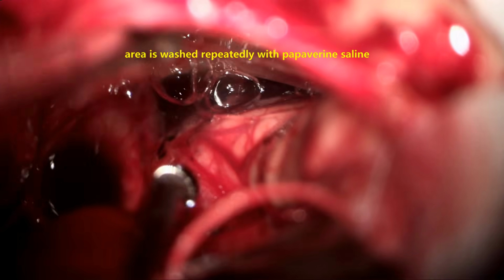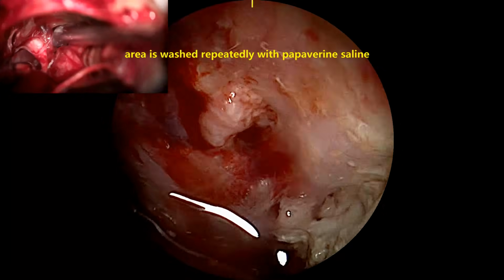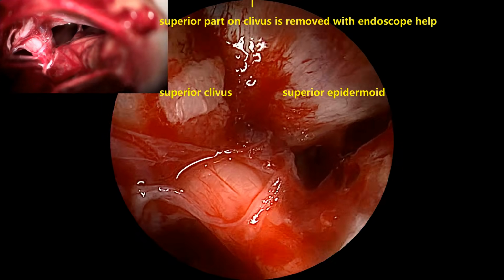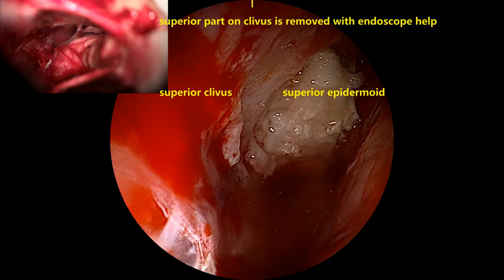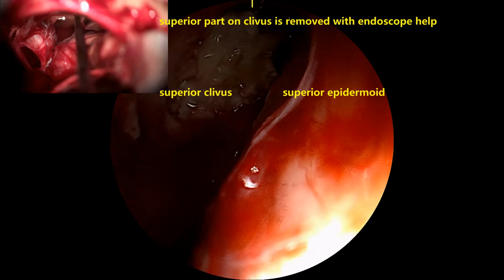At every stage, we keep washing the area with the papaverine saline to prevent the vasospasm due to the tumor chemical, and the surgical handling is of utmost importance. Now you can see the trigeminal nerve is completely 360 degrees cleared and the superior most part of the tumor is still there around the 3rd nerve and 4th nerve.